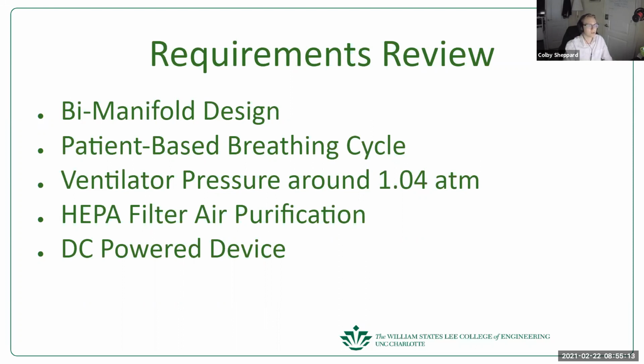It'll be patient-based breathing cycles, so they should be able to somewhat choose what their breathing cycle is going to be, or if not, it'll be based on oxygen level and stuff like that. It's going to keep a mostly constant ventilator pressure around 1.04 atmospheres.